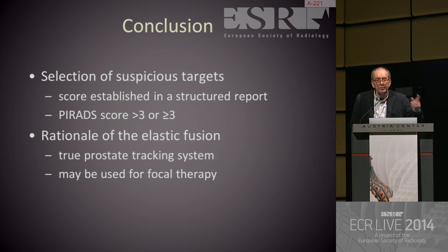And the rationale for an elastic or deformable fusion. At the moment, Koelis is the only company which provides that. Other companies provide it too, but it definitely tracks the prostate. The prostate moves. Don't worry. You can remove the probe, and at any time during the biopsy procedure, you can put the probe in again. You just track the prostate. Come back. You move. I will pick you back up and register you to my reference volume.